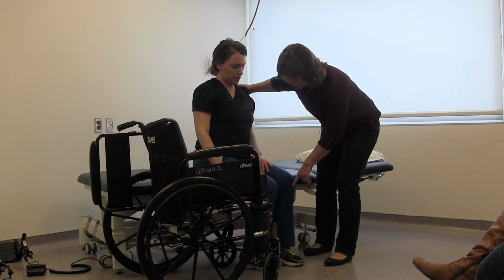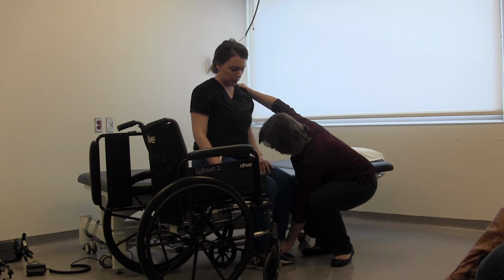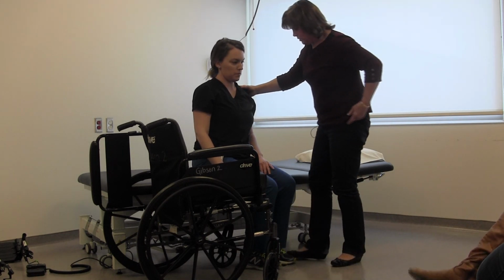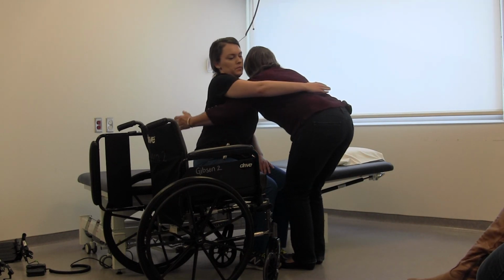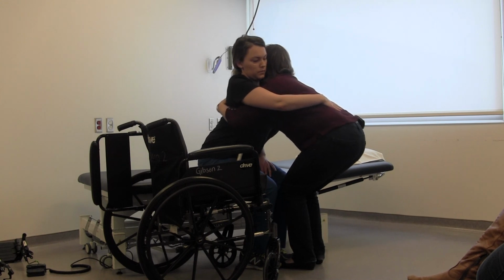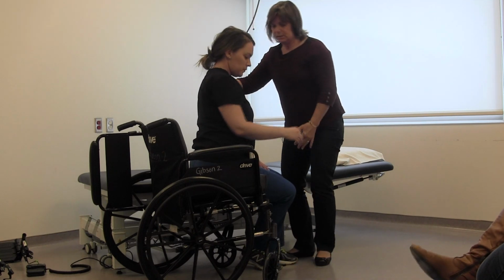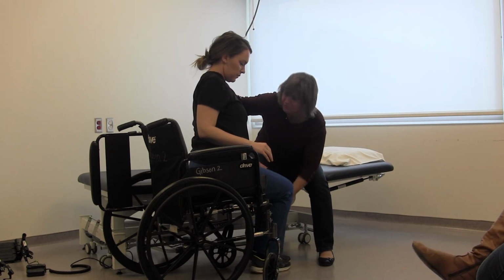Okay. Now we need to reset her feet so that they're squared up. And we're going to just repeat the process. And this time you're going to go part way on the chair. Okay? So bend forward and shift. And she's not there yet. And move her feet.